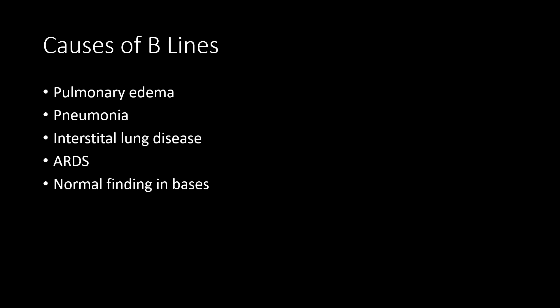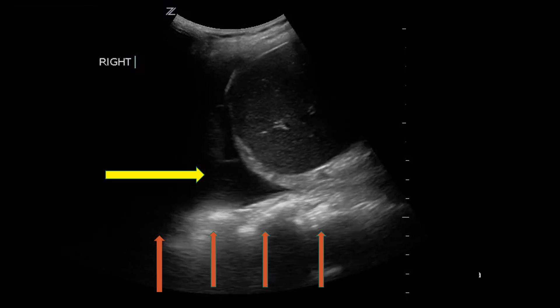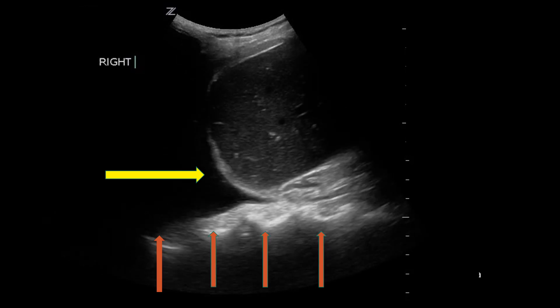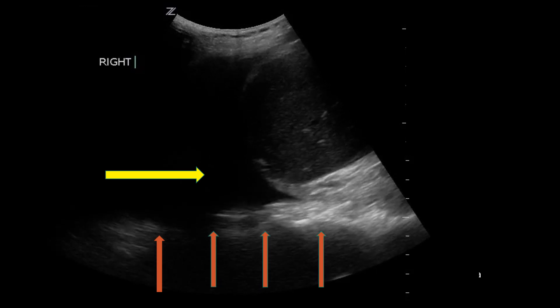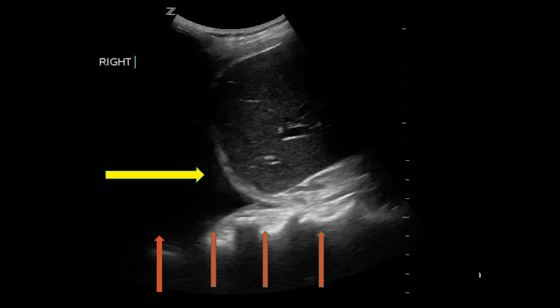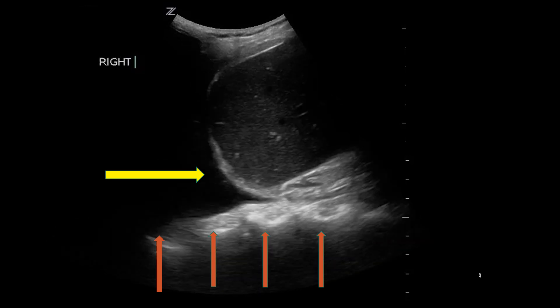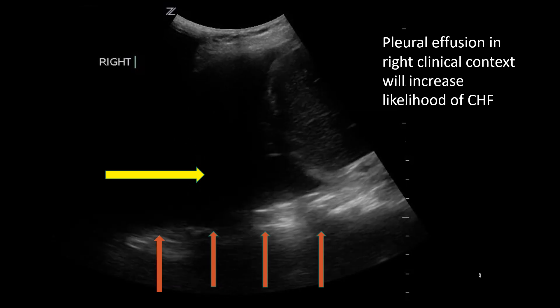B-lines may indicate different disease states, including cardiogenic pulmonary edema, interstitial lung disease, infections, and ARDS. POCUS is also very helpful to diagnose pleural effusions. You can see an effusion, which is the anechoic region superior to the diaphragm demonstrated by the yellow arrow. You can see the thoracic spine posterior to this marked by the red arrows, which normally with no effusion you would not be able to see — this is known as the spine sign. Pleural effusion on POCUS in the correct clinical context will increase the positive predictive value for CHF.